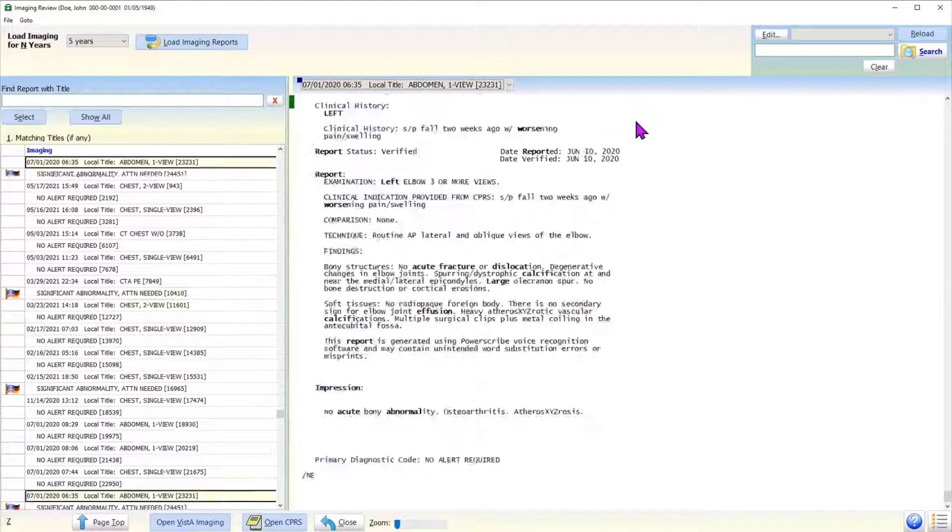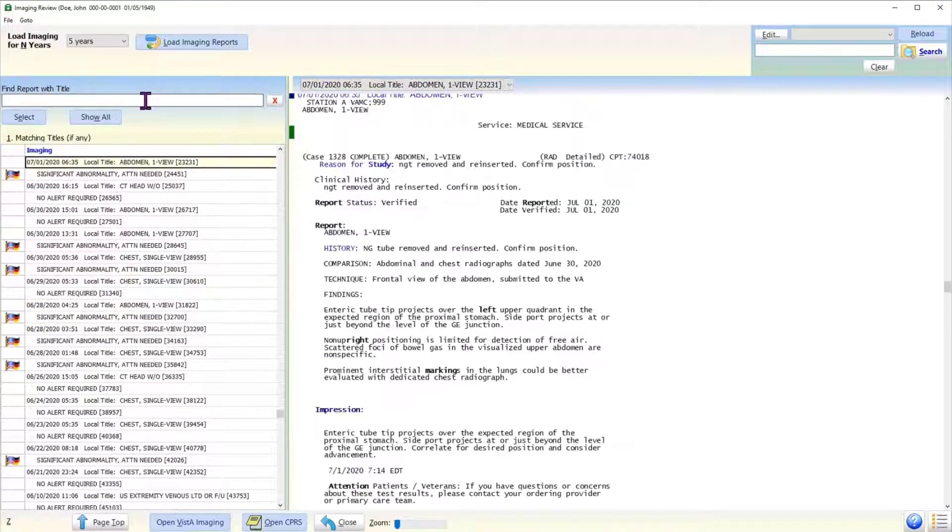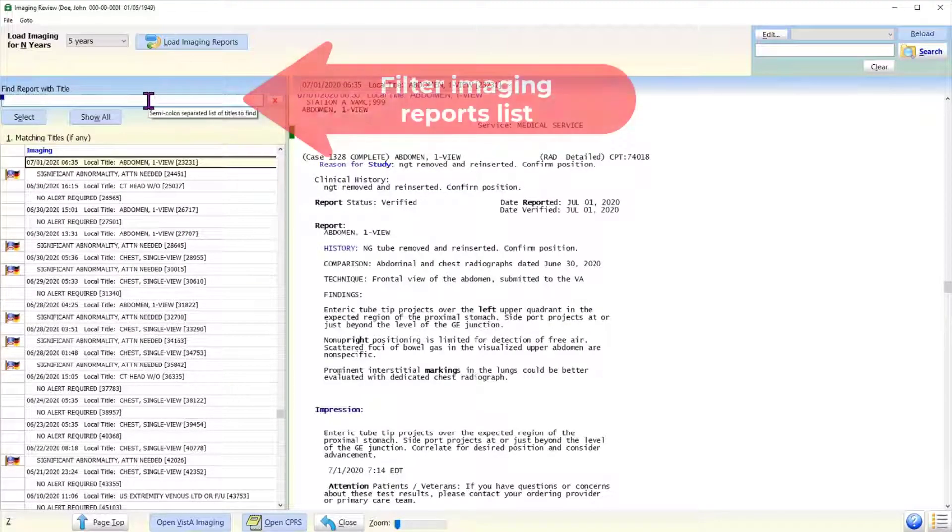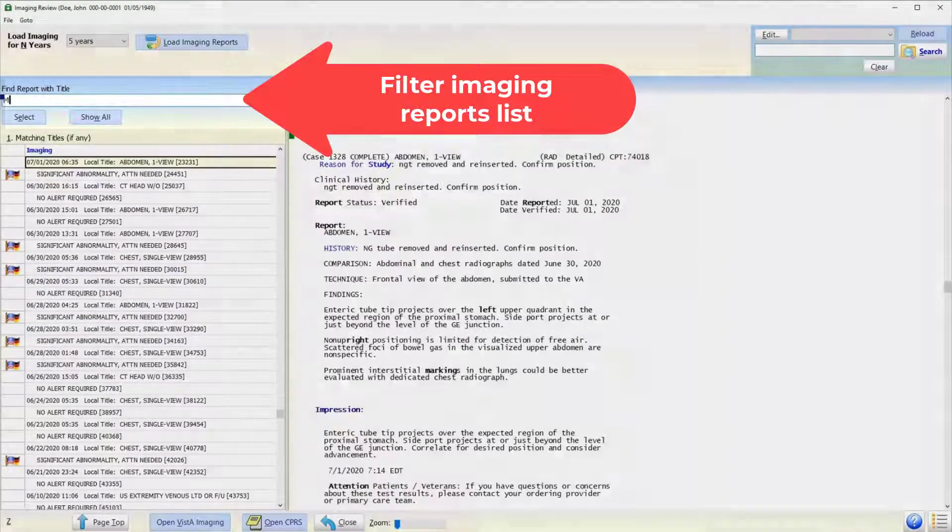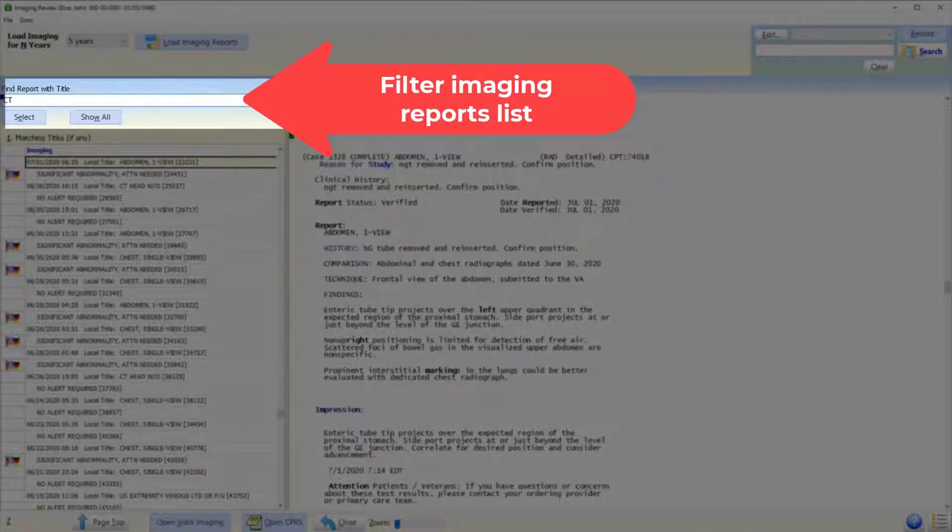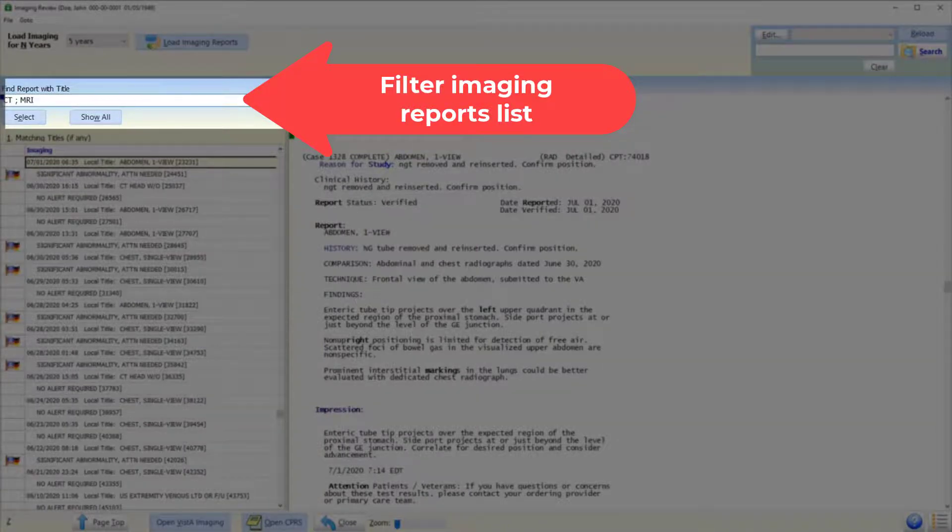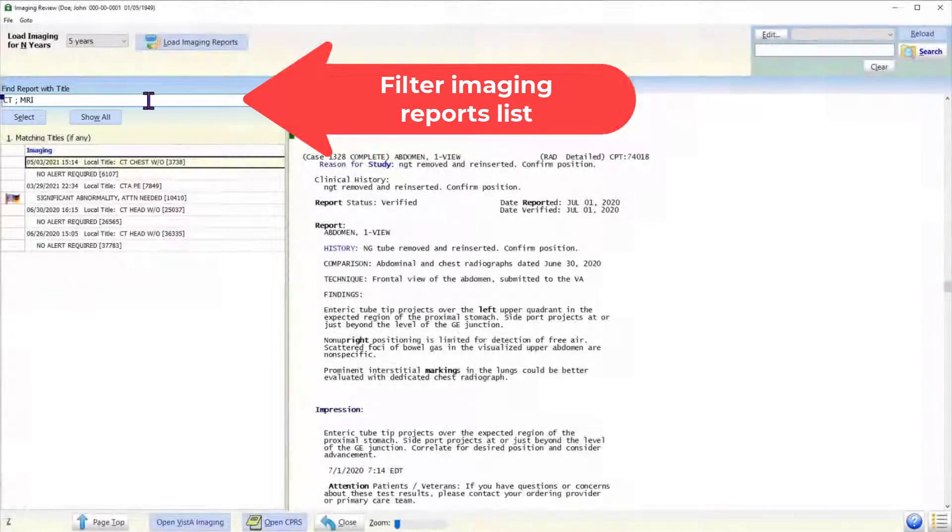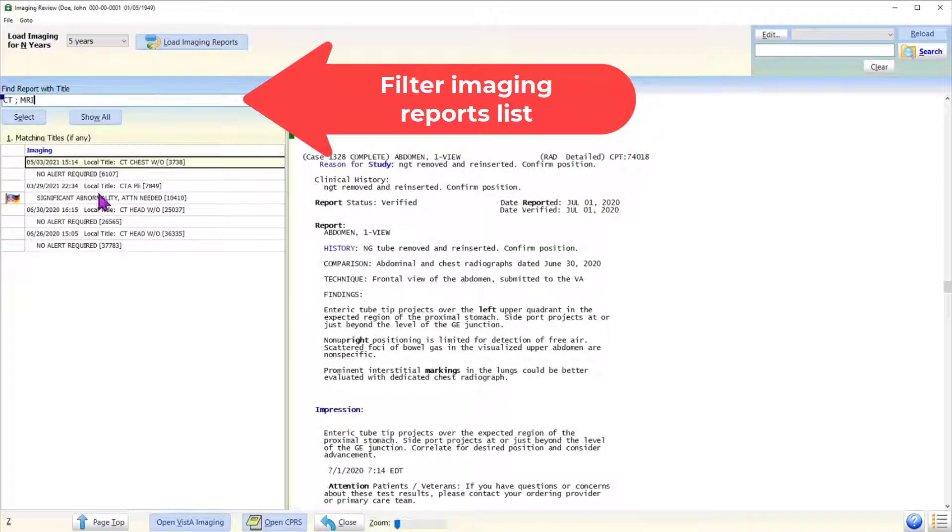The user interface just above the reports list enables the user to narrow down the list to the desired titles. For example, the user may want to review the CAT scan or MRI reports only.